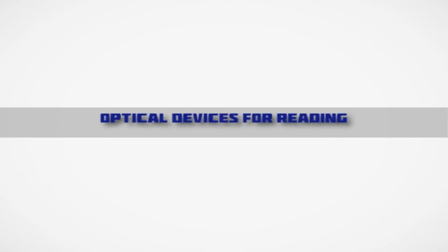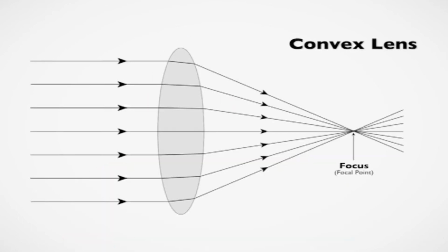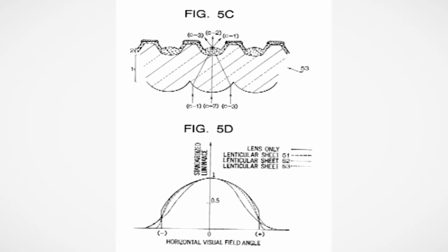Optical devices for reading: spectacle magnifiers. Low vision spectacles are monocular or binocular convex reading lenses mounted in standard full diameter or half eye frame. In other words, they are really simple magnifying lenses fitted into a spectacle frame. The convex lens functions to enlarge the images projected on the retina. The lenticular design lenses have less peripheral aberrations.